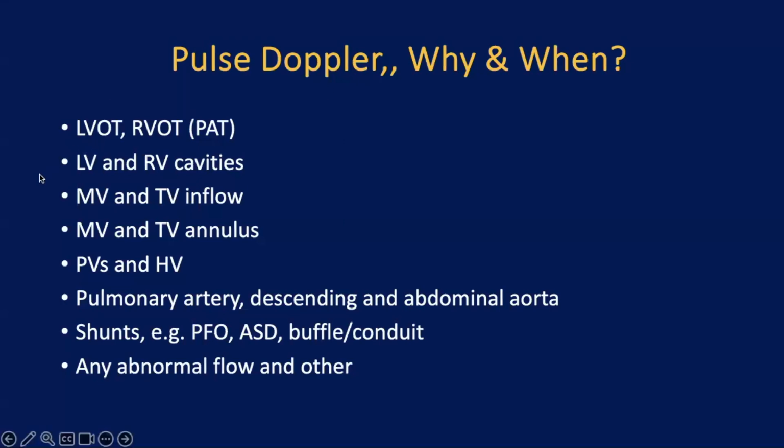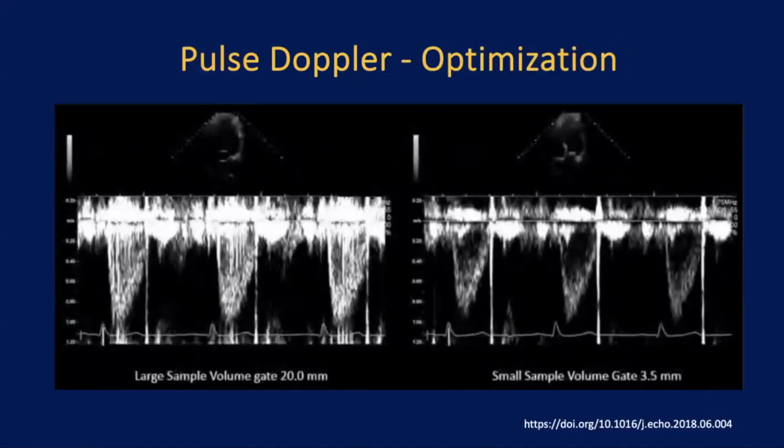However, most of the time you want to be specific and you want to measure the sample volume at that site, to calculate the volumes and to know the exact disease at that place and to verify if there is any abnormality or not. So in Doppler in general, we need to optimize it.